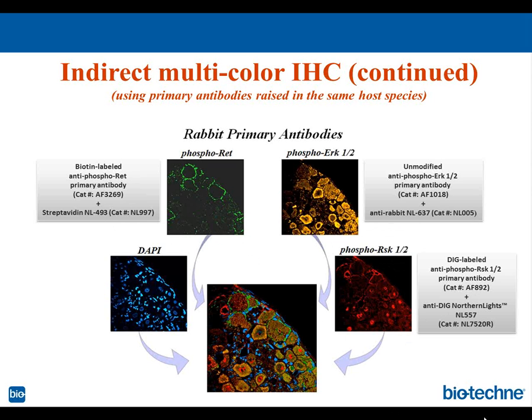We would do incubation first with the mixture of primary antibodies conjugated to all different haptens, followed by incubation with anti-hapten secondary antibodies. This is too good to be an easy solution, because the problem is to find these haptens, what can be used as haptens, and if they are good enough for detecting with the antibody that can be raised against them.